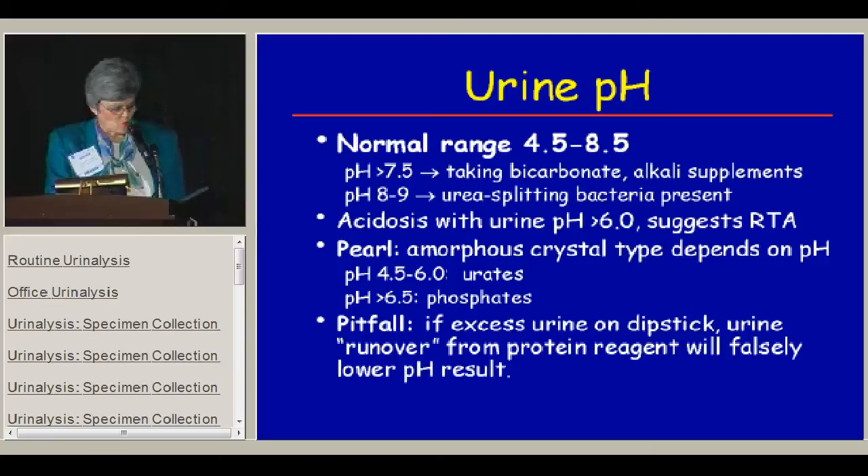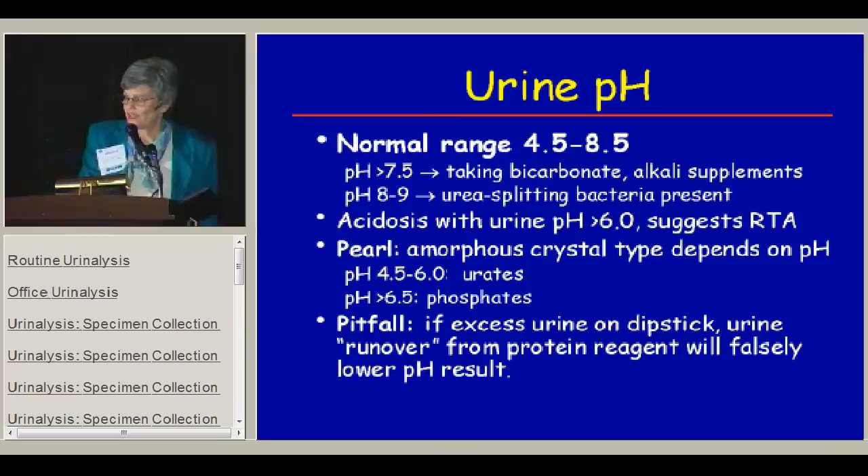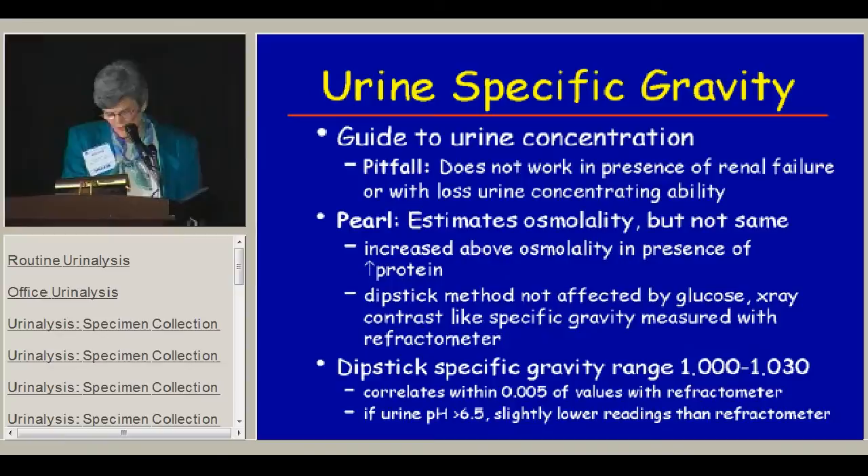The pearl for the pH is that it determines what kind of amorphous crystals you might have: an acid pH means urates, and an alkaline pH means phosphates. One pitfall of the pH dipstick is that if you have excess urine on the dipstick, urine will run over from the protein reagent and falsely lower your pH result, so you have to be very careful how much urine you put on the dipstick.